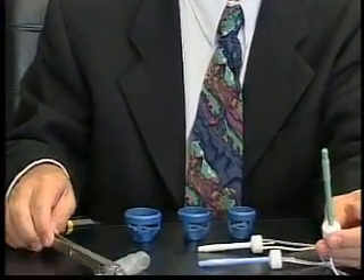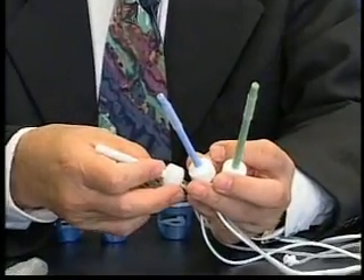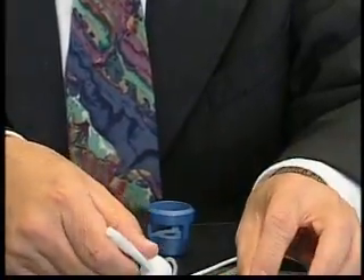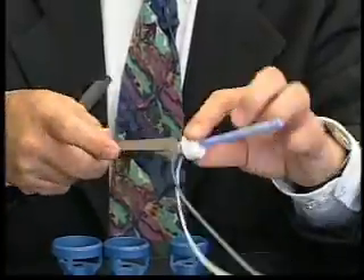The roomy uterine manipulator, with its three tip sizes — namely 10, 8, and 6 centimeter depths — enables the mobilization of the uterus very effectively.